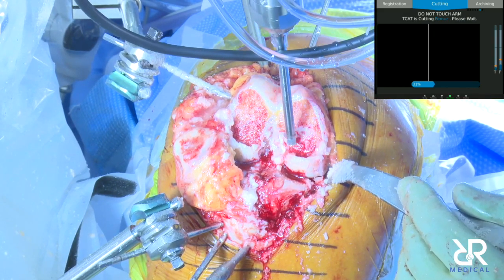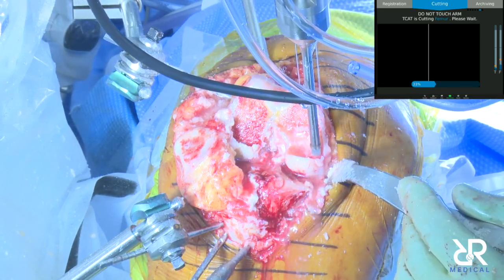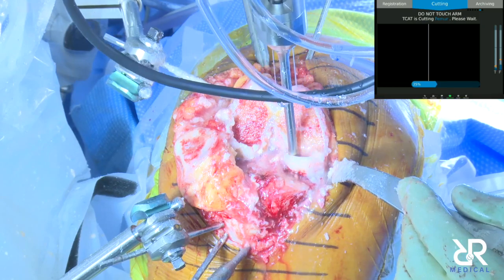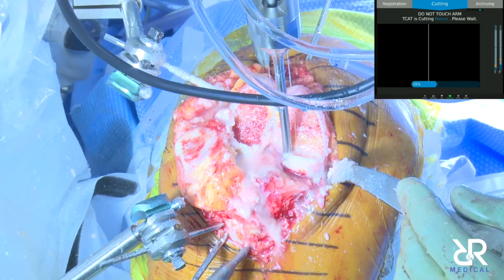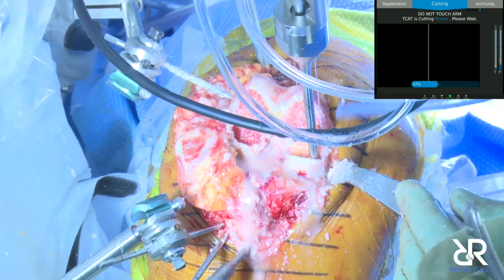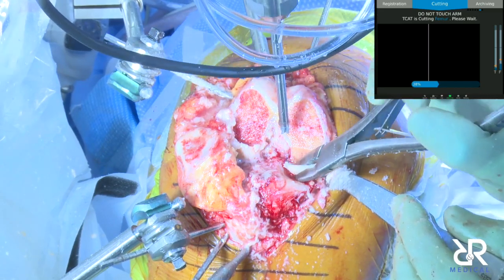Yeah, it's soft bone. I think if you put in the implants right, because I do kinematic alignment, your ligament balancing is minimal.